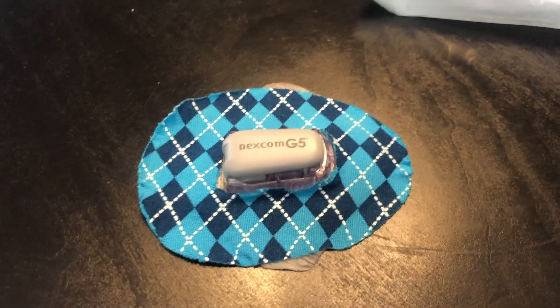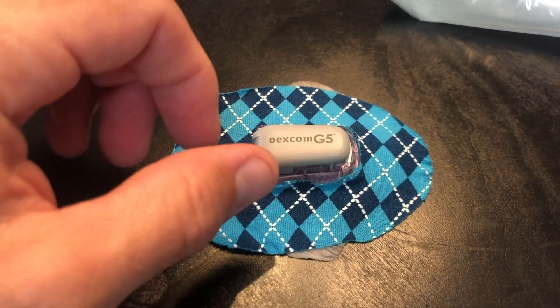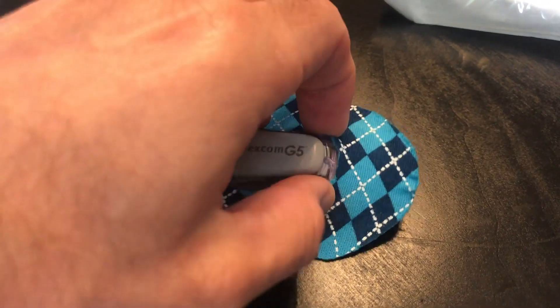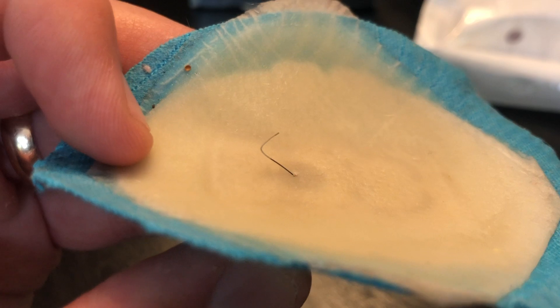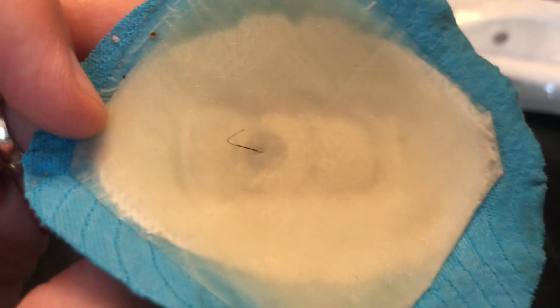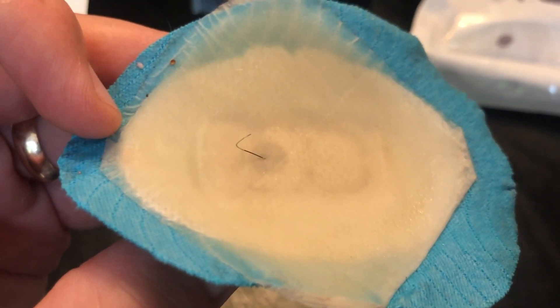Here you can see the G5 sensor I've just taken off my son. We actually used a Rockadex because he was taking some time in the swimming pool, but you can see on the back that the lead does punch right through this hydrocolloid bandage. I wanted to show you that because obviously you won't be able to see it on the new one I put on.